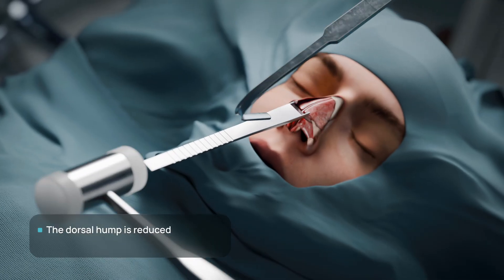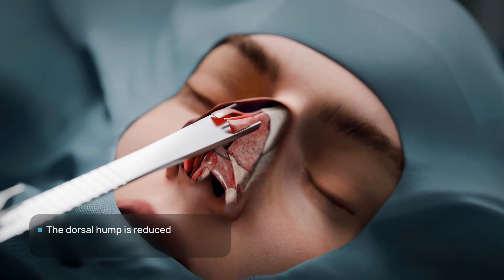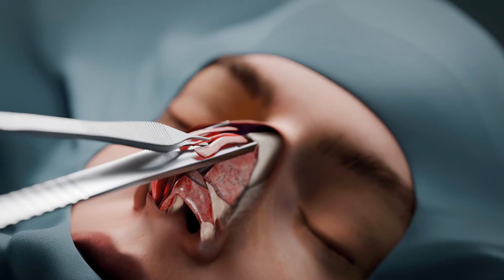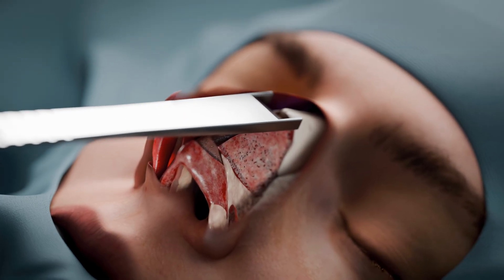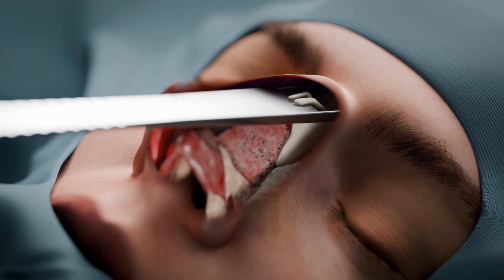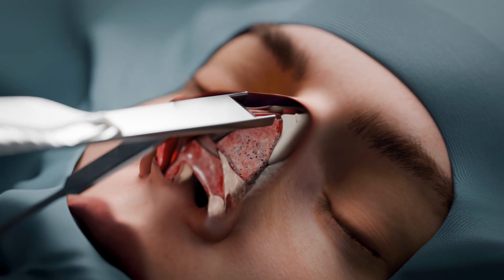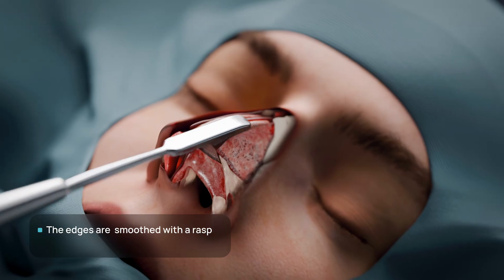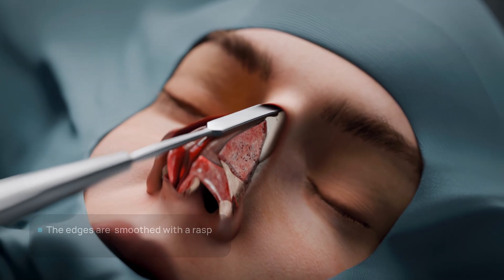The osteocartilaginous dorsal hump is subsequently removed. An osteotome is used to resect the protruding bony and cartilaginous components, followed by refinement with a rasp to achieve a smooth and balanced nasal profile.